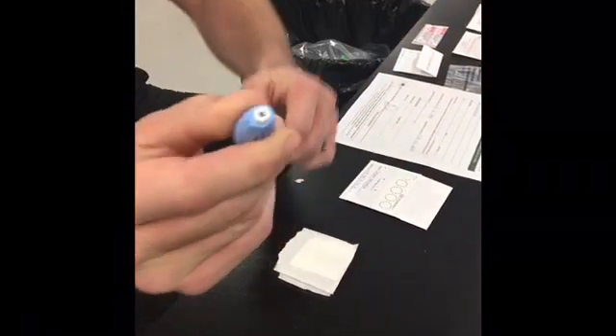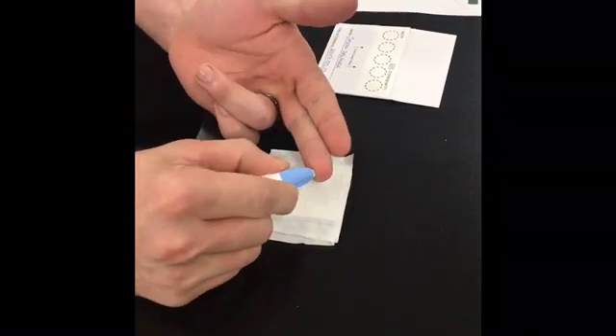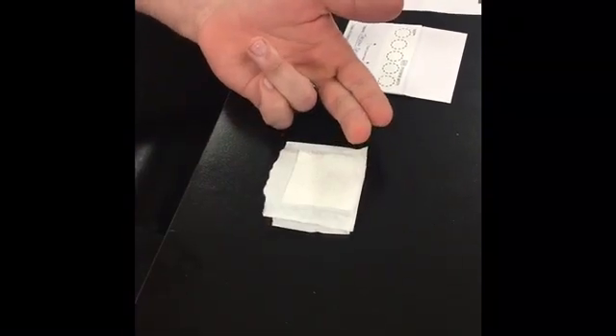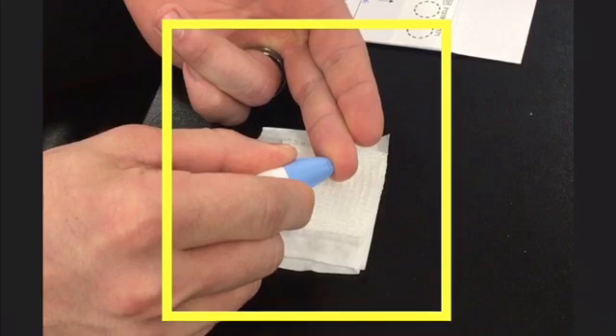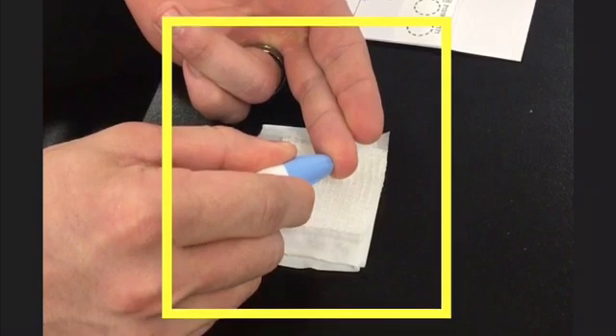Take the single-use lancet and remove the protective safety cap. Lay your hand palm side up on a hard surface. Place the tip of the lancet against the chosen, sterilized fingertip, off-center from the fingertip pad as pictured in the instructions. Press the lancet firmly against the site until it clicks to activate the puncture device.